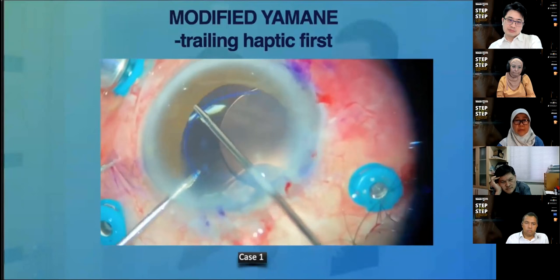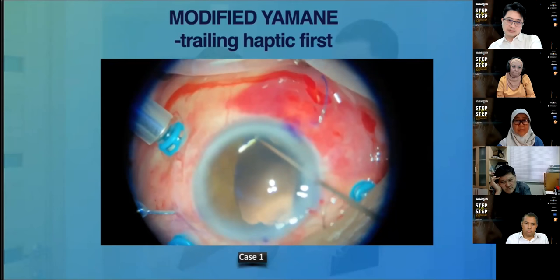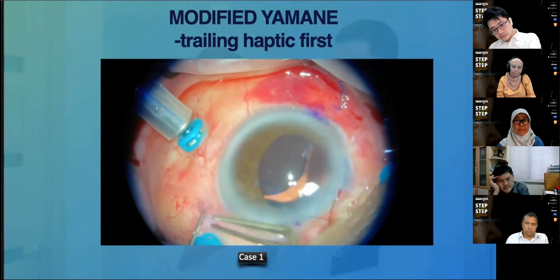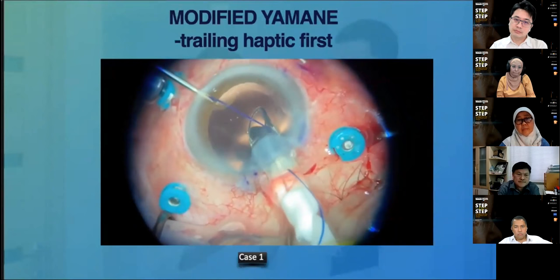So in general, this step probably gives more space and is suitable for PMMA haptic, as it gives a bit more space by keeping both haptics outside the eye. I think this technique was popularized by Dr. Brian Kim because he feels that dealing with the trailing haptic is quite tricky. So he tried to manipulate and see whether there's a better way of dealing with it. And number two, when we first learned to do the Yamane, some surgeons were actually using the PMMA haptic, which is quite rigid. So this is one of the techniques which I think gives a bit more space for us to deal with the rigid PMMA haptic.